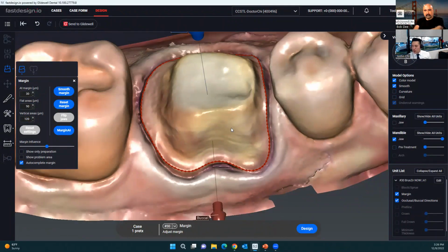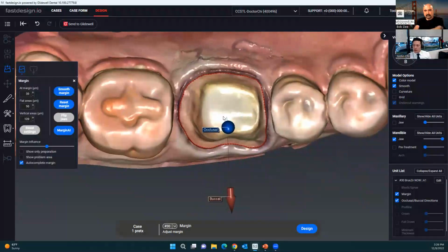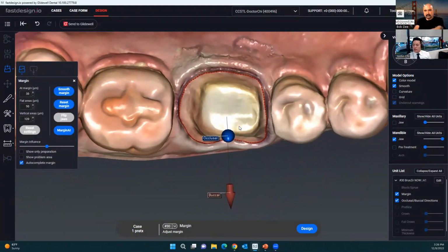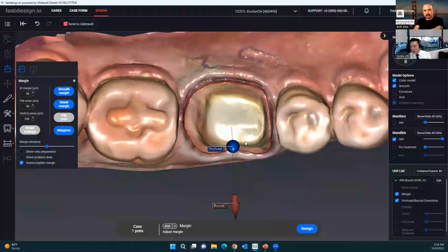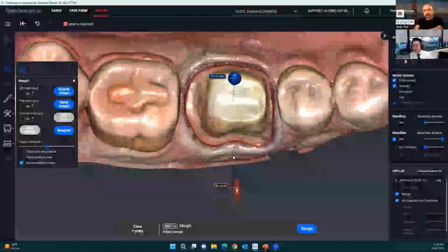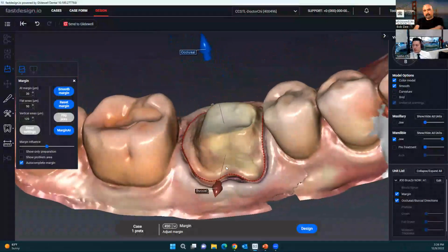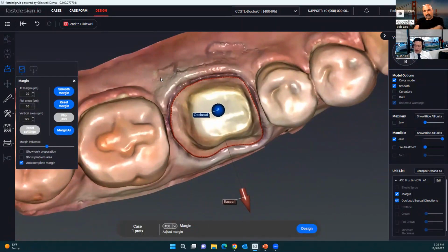Now, those arrows that we spoke about a minute ago, I'm going to turn off curvature. The occlusal and buccal directional arrows: once the margin is marked, the software puts these arrows on, essentially identifying to the system what is north, south, east, and west, what's buccal and occlusal. This will help feed that information into the design algorithms to create a really accurate design proposal. Right now, what I normally do is look straight down on the occlusal plane, and from there you can double click on the blue arrow and it points straight to the occlusal. That way, for the prep and for this design, it's going to match the occlusal of the adjacent teeth.